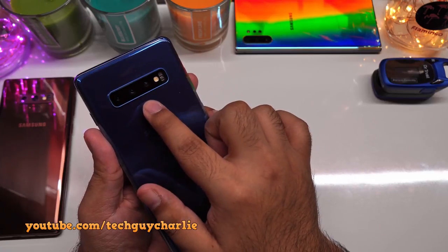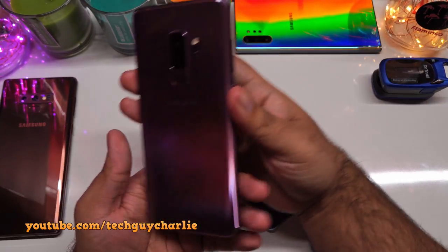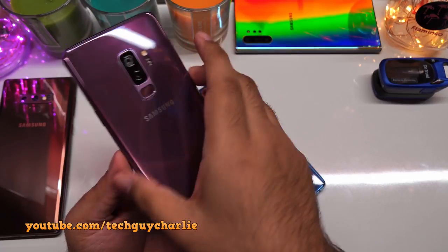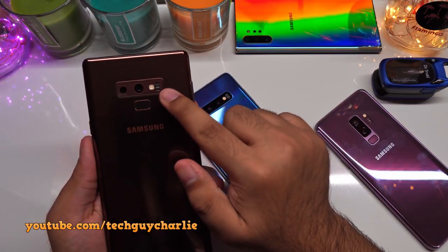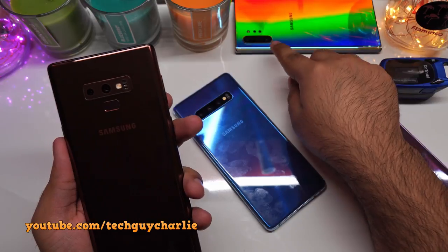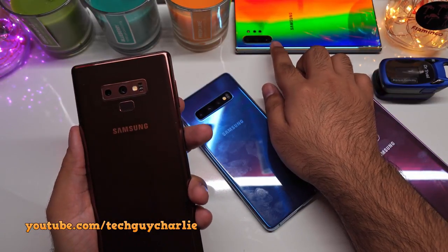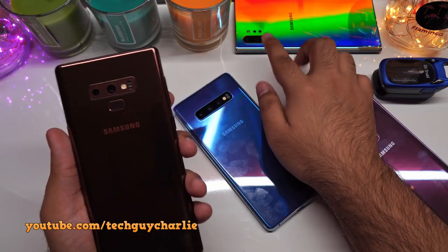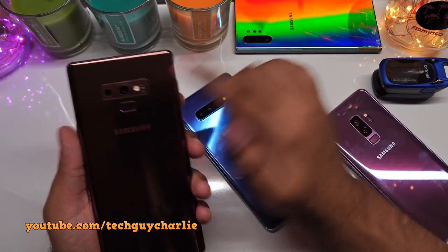This is the Galaxy S10 Plus, I've got the Galaxy S9 Plus with the pulse oximeter sensor, and also the Galaxy Note 9, which also has the sensor built in. Unfortunately, the newer flagships like the Galaxy Note 10 Plus and the Galaxy S20 do not have the dedicated pulse oximeter sensor.